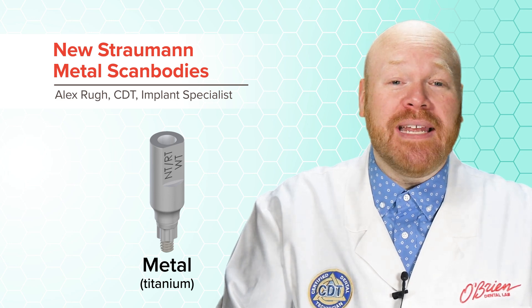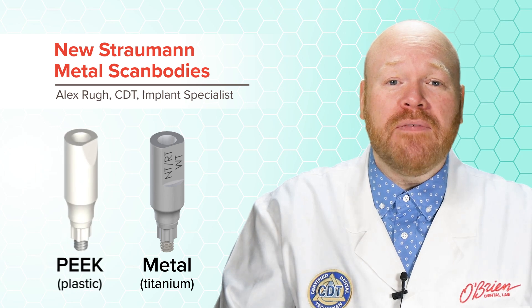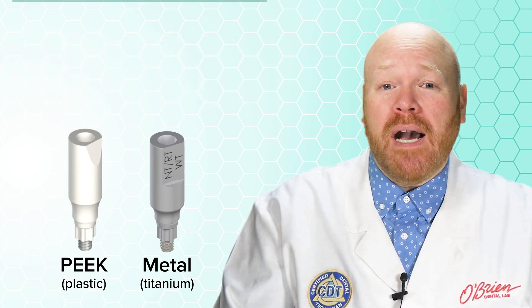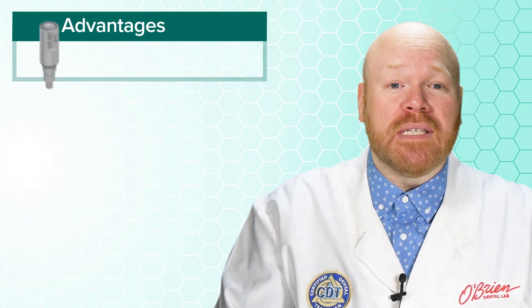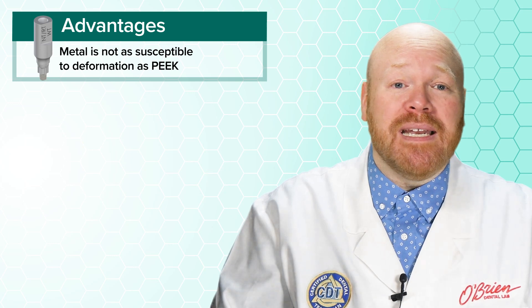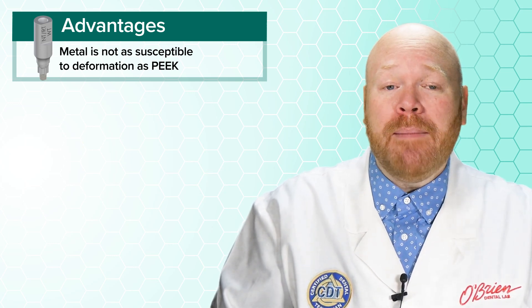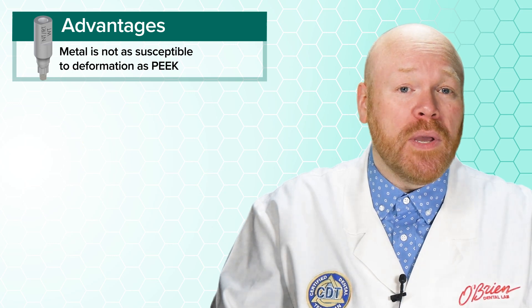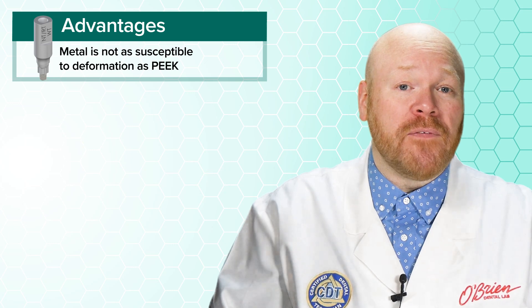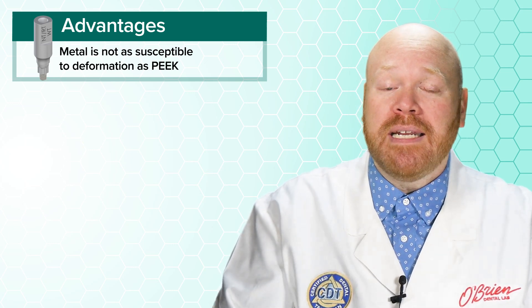These new scan bodies are made entirely of titanium, which is a big improvement over the previous version which was made of PEEK plastic. Titanium isn't nearly as susceptible to deformation as PEEK. PEEK scan bodies will typically warp with repeated use, but worse than that, they can even be deformed on first use if proper care isn't taken to ensure that they're being seated correctly.